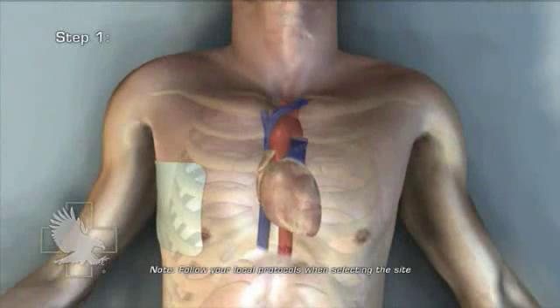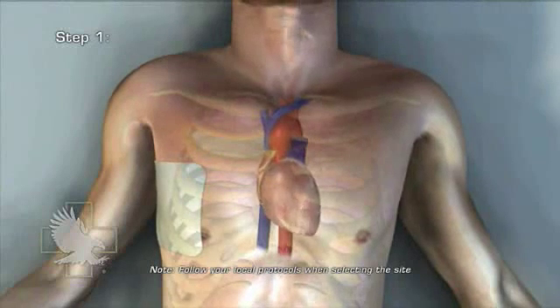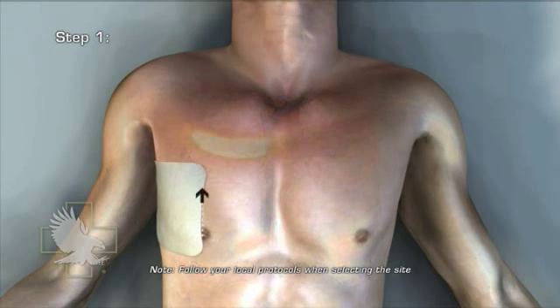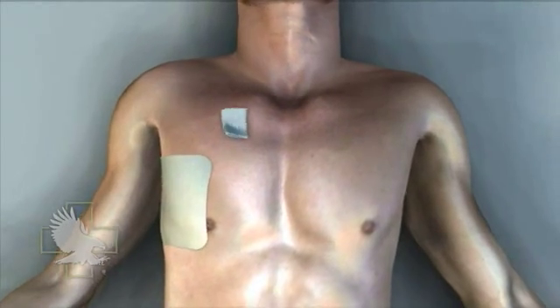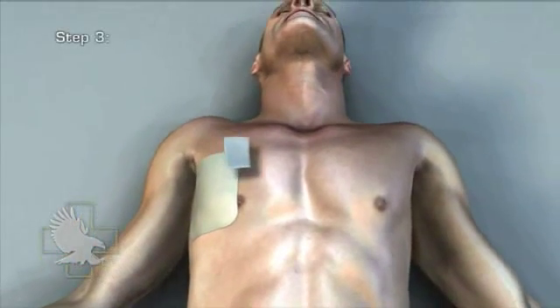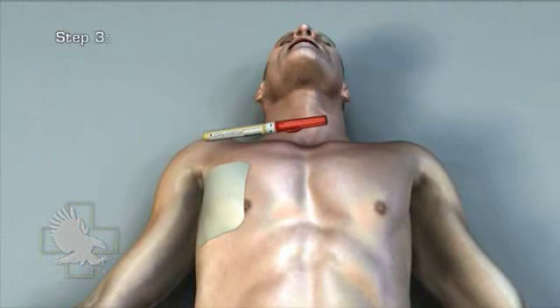Step 1. Select site. Affected side, second intercostal space, mid-clavicular line. For reference, you should never insert a needle closer to the center of the chest than a line drawn from the nipple straight up to the collarbone. Step 2. Cleanse site with antimicrobial solution. Step 3. Remove red cap with twisting motion. Step 4. Remove ARS from case.